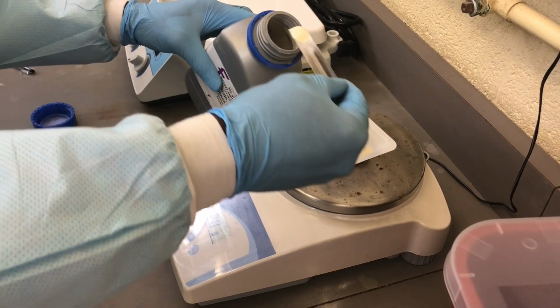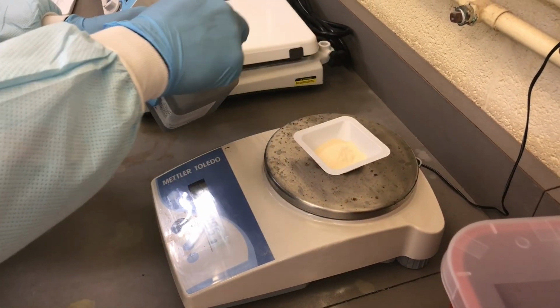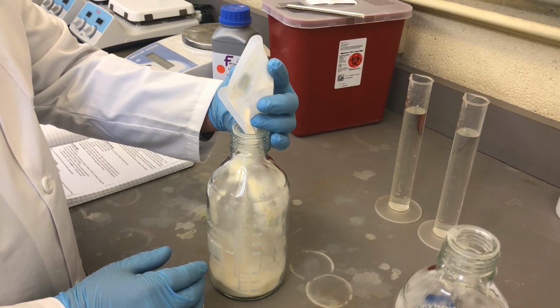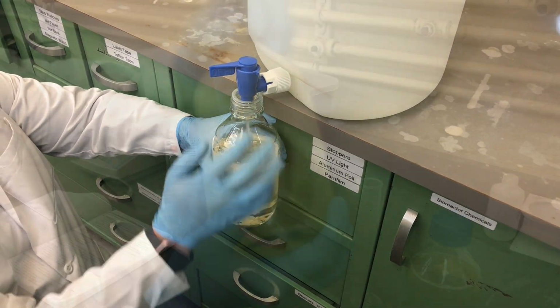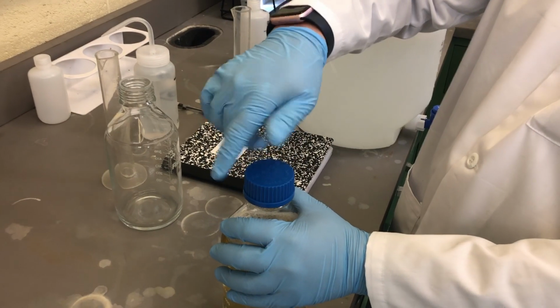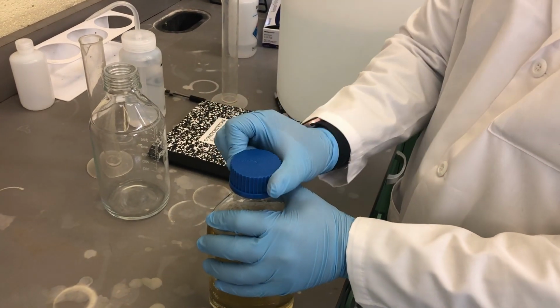To make 1 liter of LB media, weigh out 20 grams of LB broth and pour it into a 1 liter glass bottle. Then bring it up to 1 liter with DI water and shake vigorously. Finally, the cap is placed on loosely to avoid the high pressure of the autoclave.